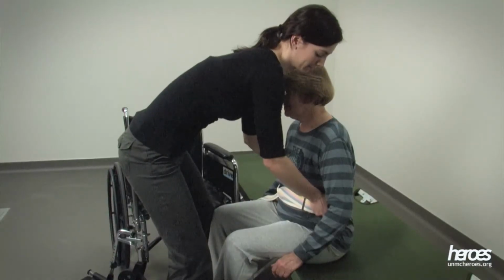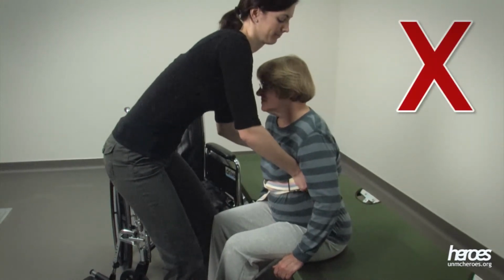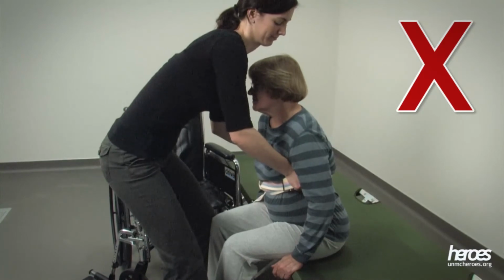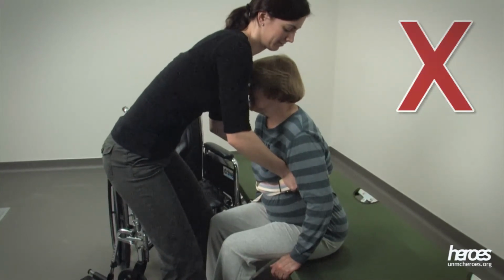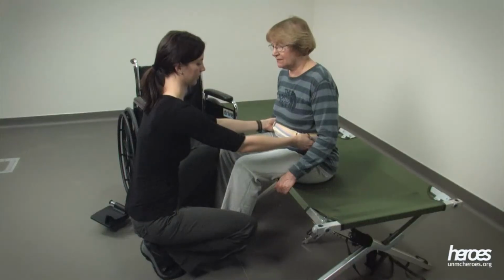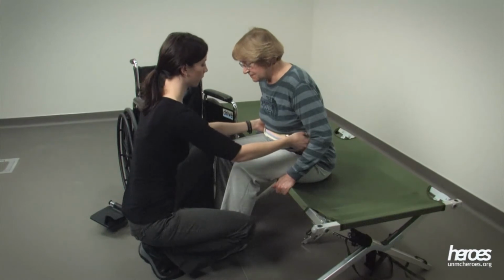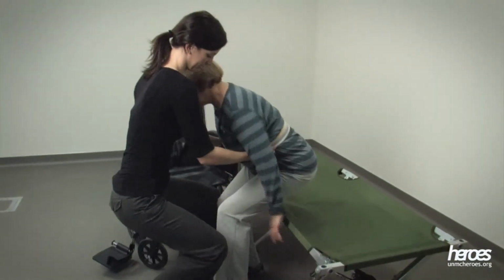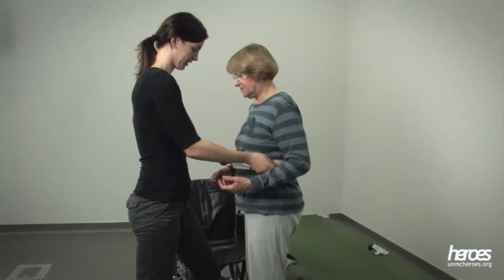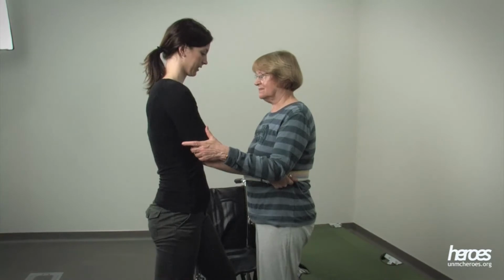Make sure that when you are helping the individual get to a standing position, you are not simply trying to pull the individual up by the gait belt. This is uncomfortable for the individual and increases your risk for injury. As you help the individual come to a standing position, use the transfer of the weight of your body as it moves from a mini squat position to a standing position. By keeping your body close to the individual's body, you minimize the amount of work you have to do.